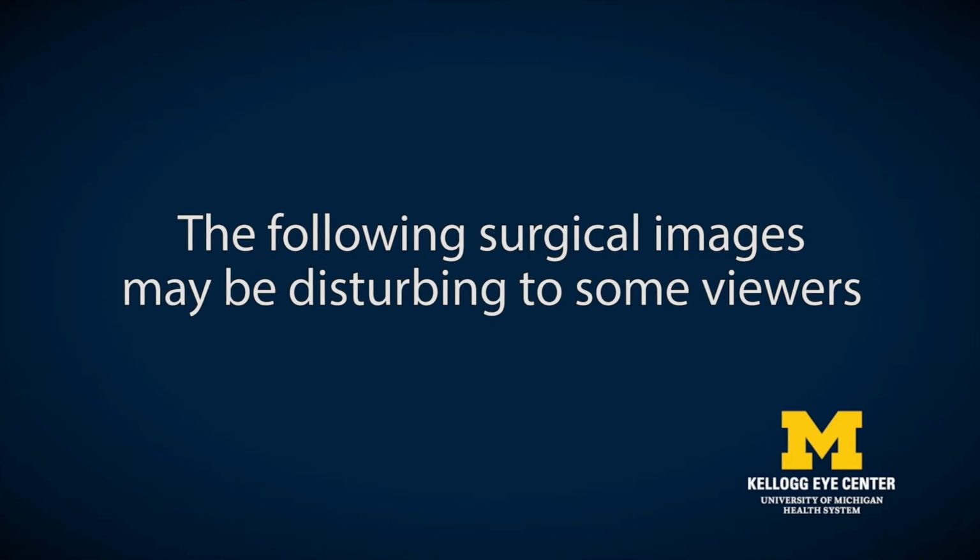And instead of just a couple points of attachment that allow blood to get under it, it seals this area and really prevents any kind of blood accumulation from forming. This has, again, allowed these grafts not to contract and has dramatically changed their appearance for these patients. We'll show you a few examples of patients who previously were not able to wear a prosthesis, but now are able to wear a prosthesis and function quite normally.